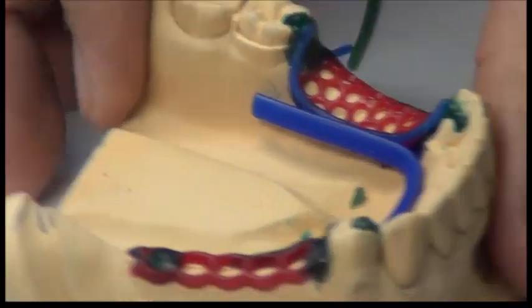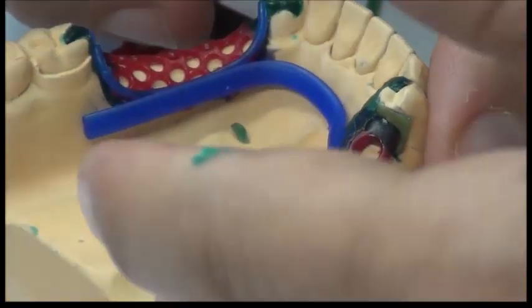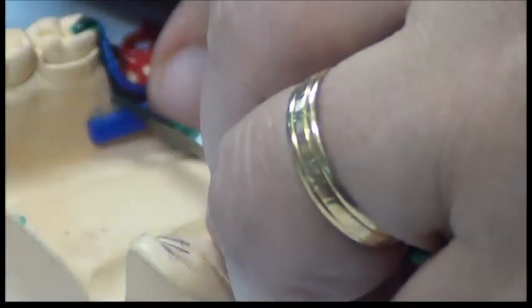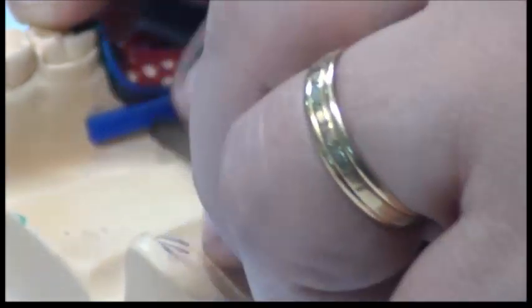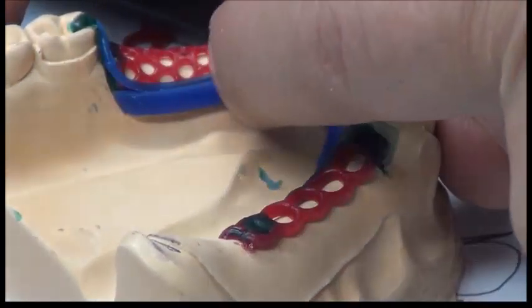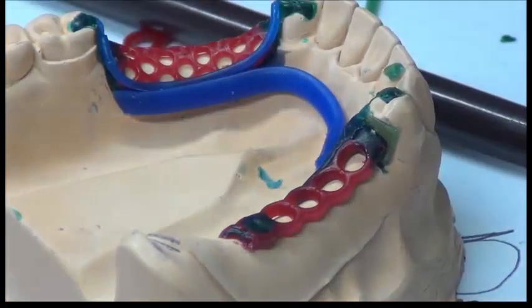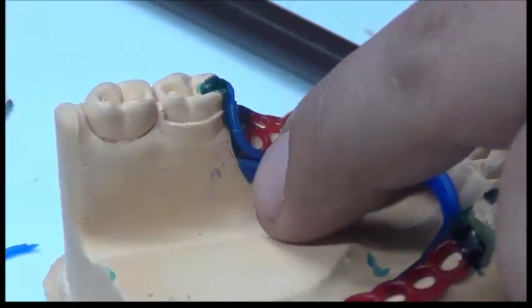So this is the morphology of it. Okay? Once more, it extends from the bounded saddle area. I'm going to cut also the excess. It runs with the external finish line on the bounded saddle area. It runs along it. Okay, it runs along the external finish line up to the last part of the bounded saddle area.